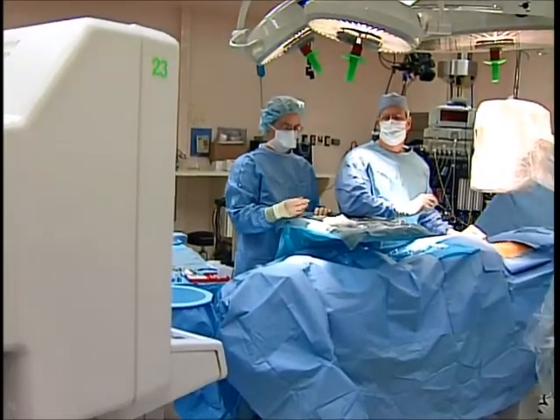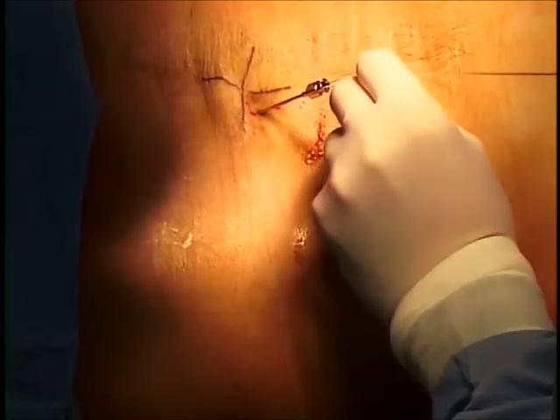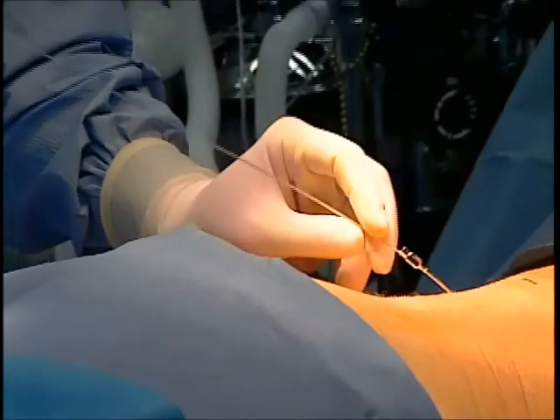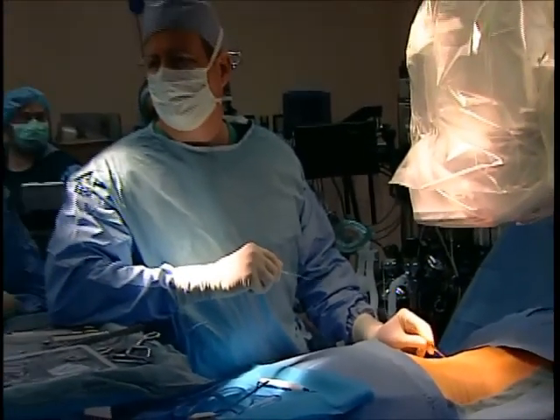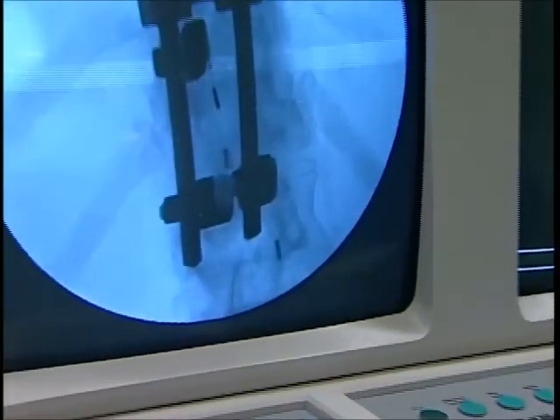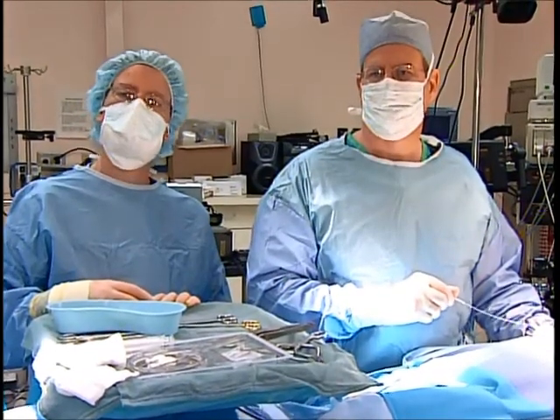Bill Dotson entered this operating room with the hope that he might walk again. Now, complications are jeopardizing the chances of accomplishing this medical miracle. We ran into some scar tissue because he has some hardware, some rods in his spinal cord to support after his initial accident. All right, we're in business.